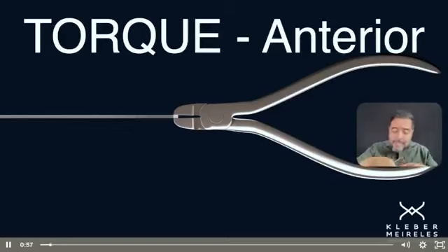When I apply the torsion in the wire, I will have the opportunity to see what that torsion is going to apply in real life to the teeth, meaning the inclination of anterior teeth going buccal or going palatal. I can do everything when I apply the torque.